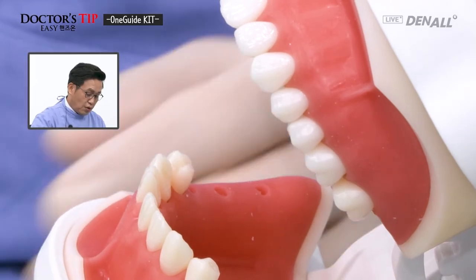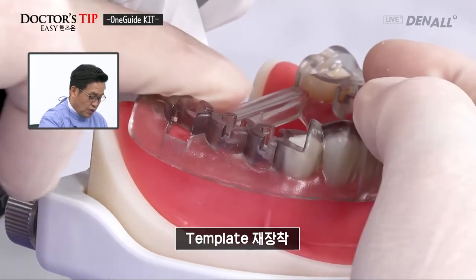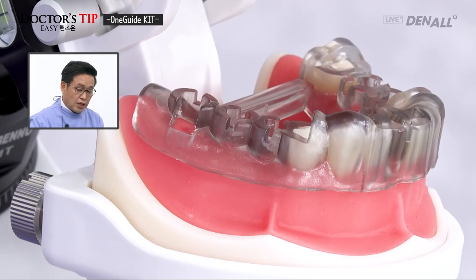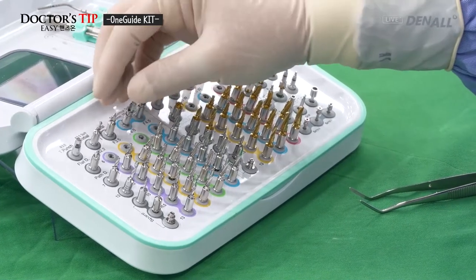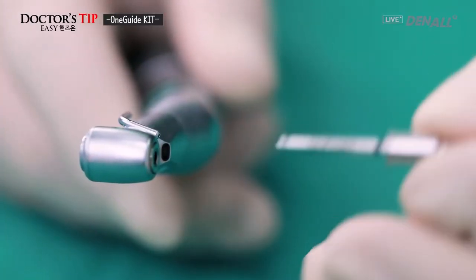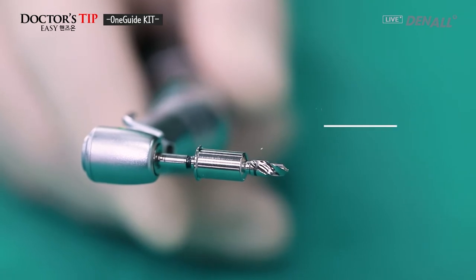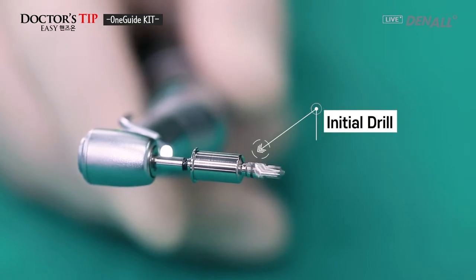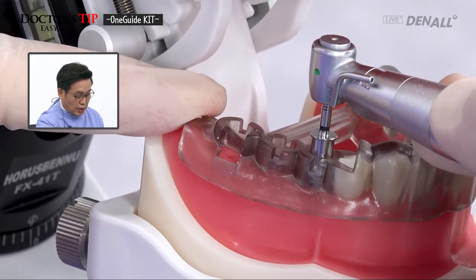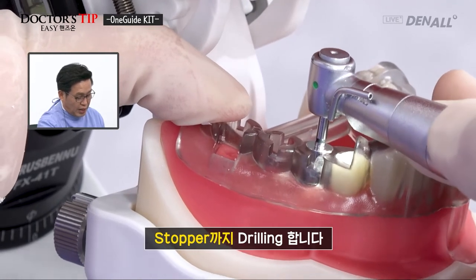The tissue punch was used to remove gingiva. The template is going to be placed on. Now we are going to proceed. Tissue punch is done, and now use the initial drill. As shown, the initial drill is used. As shown, I'm going to connect it and I'm going to drill full length.